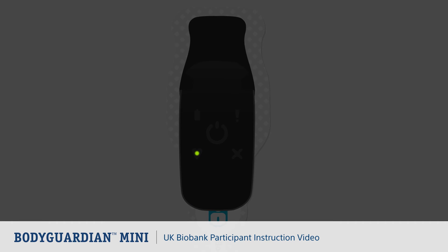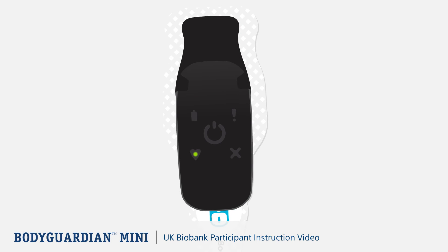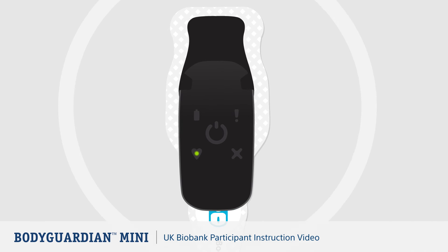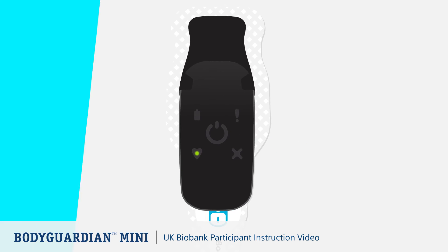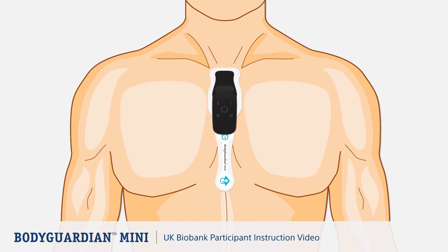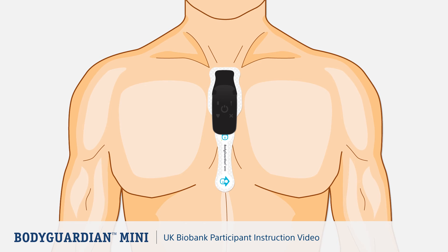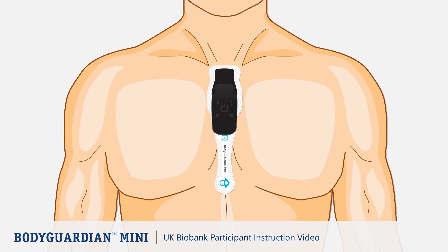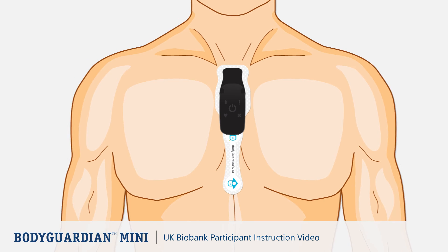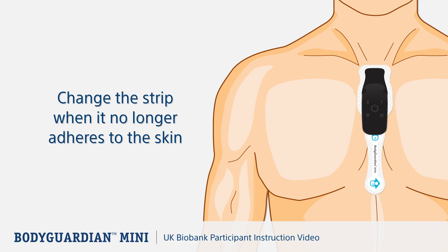The lights can be best detected in a dark or dimly lit room. There's also an audible indicator. If you cannot detect the blinking green LED light on the monitor, press and release the center button. While the Bodyguardian Mini Strip Adhesive Patch is designed to last, on certain individuals the wear duration could be shorter. If the patch is not sticking well, change the strip when it no longer adheres to the skin.